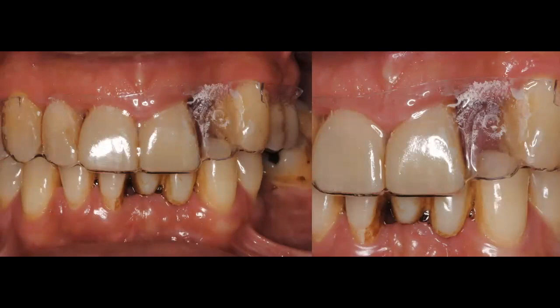Again, what this suck down is giving you now is the facial aspect of tooth number 10, and the lingual aspect of tooth number 10, of the future tooth number 10.